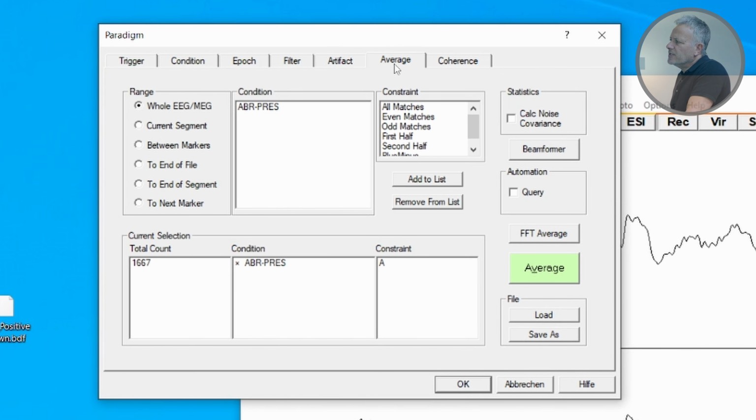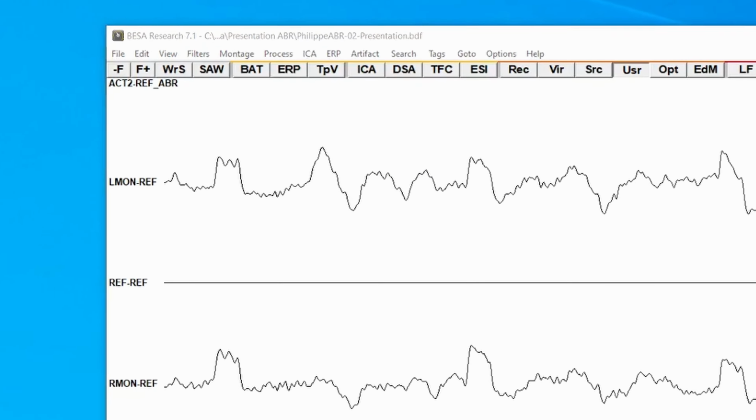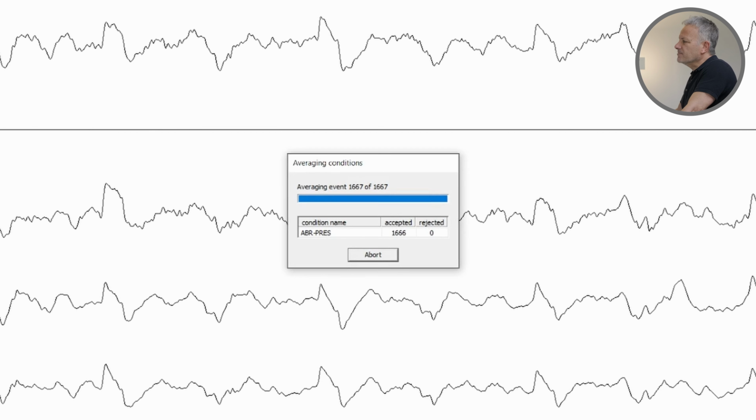We click to average. We hit ABR presentation and we hit the average button. That takes about a minute or two, and I will be back as soon as this has averaged. I can see on the screen it's still going, only another 100 sweeps, and it's finished now.